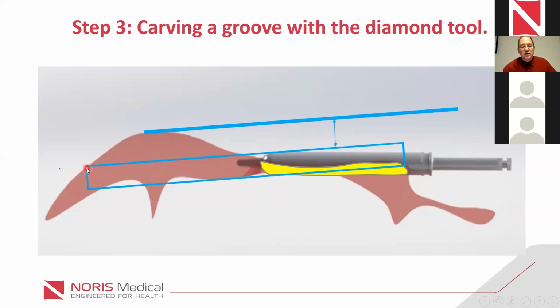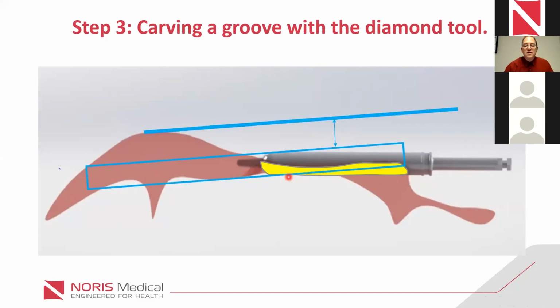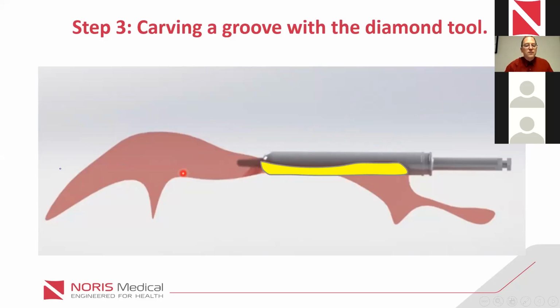Maybe it will still hold and everything will be fine and it will be a great surgery. But what I'm trying to show you is that you have different lengths of implants on the same position with only a small variation of the change of this angle versus the green angle, like 4 degrees. I have a slide for that, but for some reason it doesn't work. So that's why you need more implants when you come to a surgery.